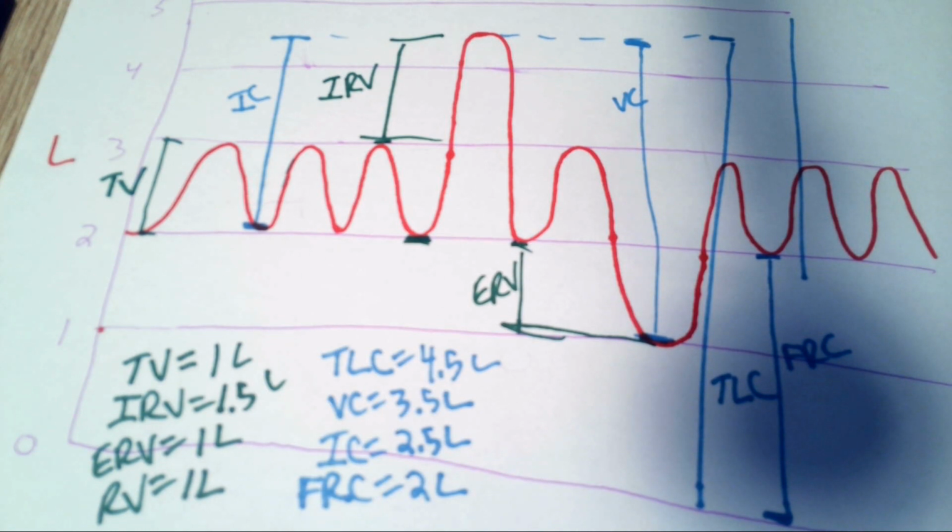per second. So when you were doing it in lab, or if you were to have done it in lab, you would have been trying to time your expiratory reserve volume to last over 3 seconds. So it's a little bit tricky, just the logistics of that, but the idea behind it is that it's measuring how well you can exhale.